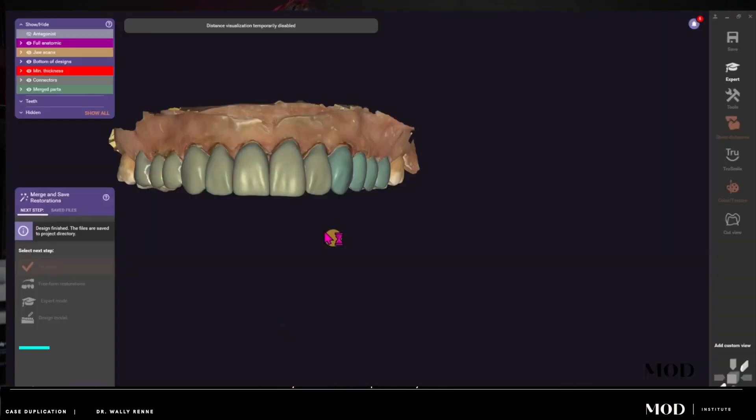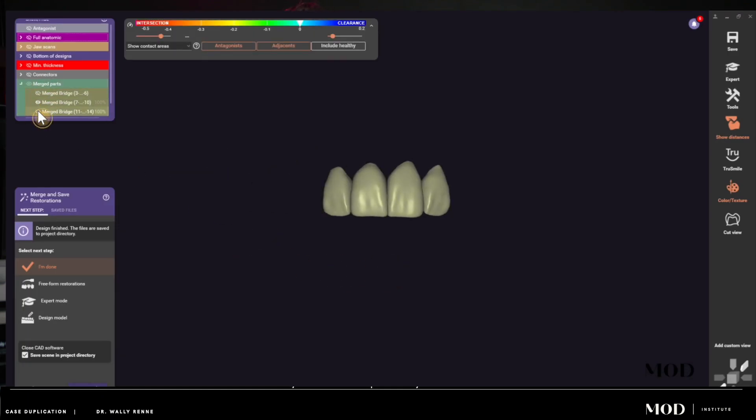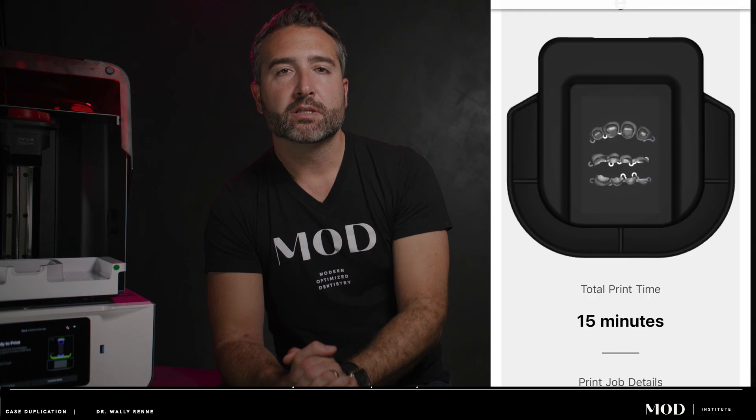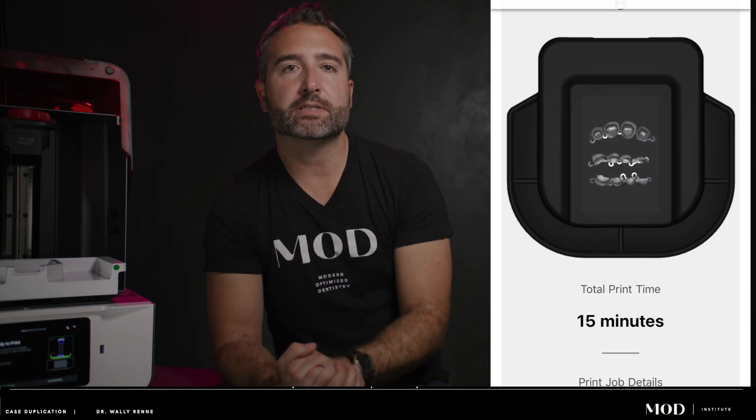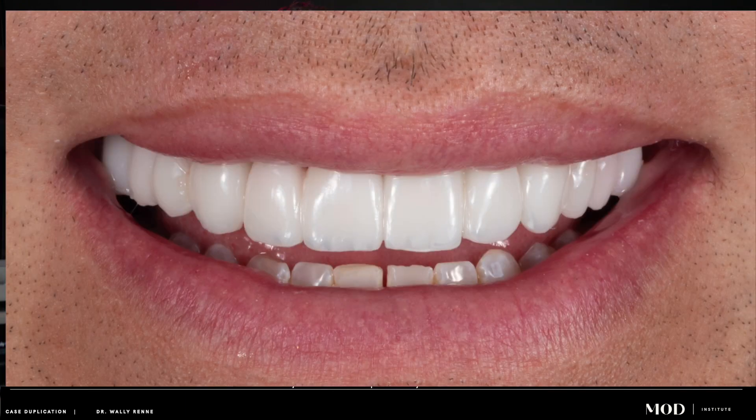That's the design in a nutshell. We have our merged files and we can now export each individual segment — three segments total — and we're ready to go for 3D printing. I'm going to throw these in my Pro 55s on the crown build plate; they'll print in 15 minutes in those three segments. I'll put them on as provisional prosthetics and get a true preview of what my final prosthetics might look like. Follow this video closely and you will save hours of design time going from temporaries to mock-ups to finals.